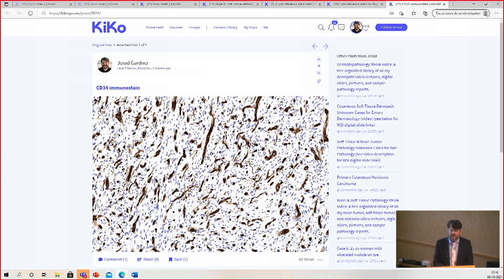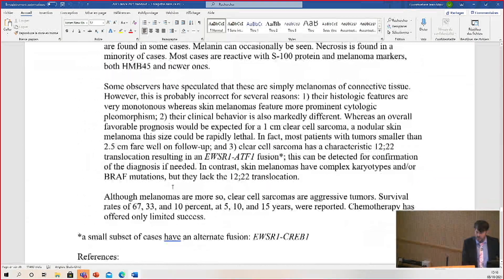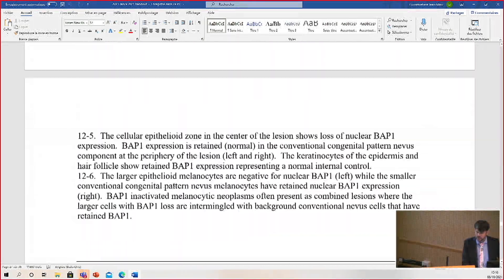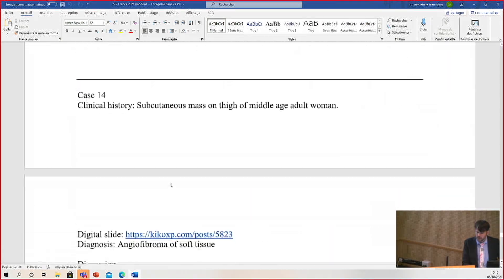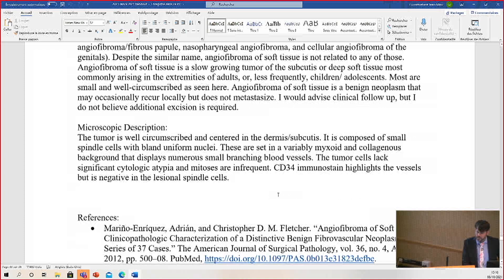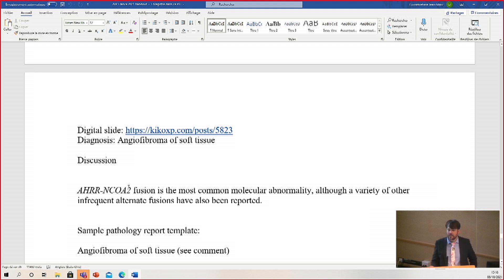These tumors have a translocation involving AHRR and NCOA2. So if you need to test for the molecular alteration, you can. But once you've ruled out the other possibilities, it has a very distinct appearance.